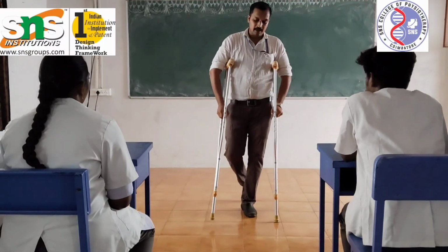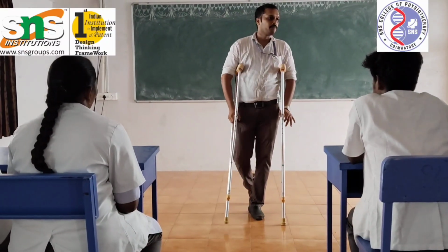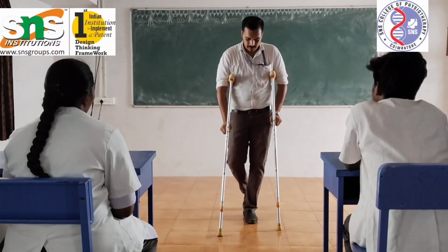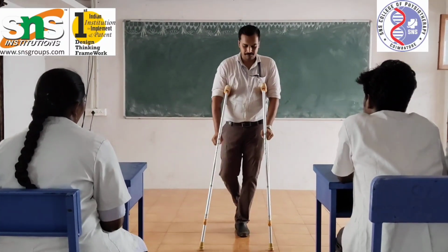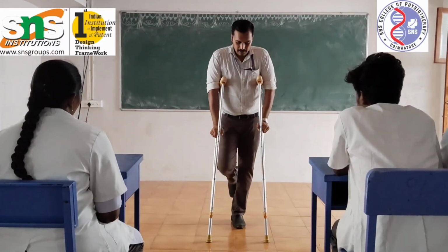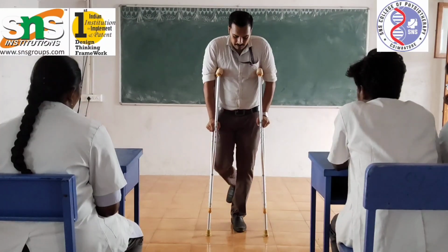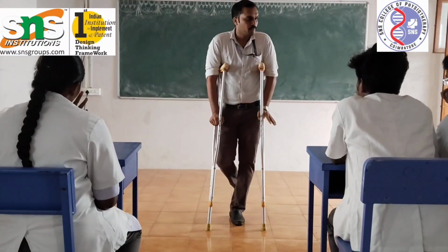In this, again, we can teach with the help of swing to and then swing through. What does it mean? From the crutch level we can draw an imaginary line. If the patient keeps the leg not beyond the line, it is called swing to.